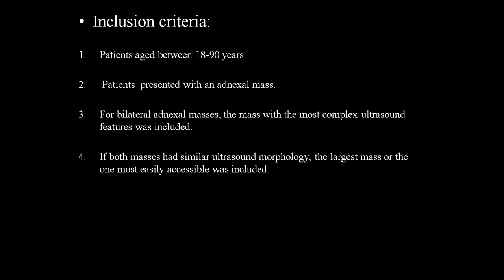Inclusion criteria: patients aged between 18 to 90 years presenting with adnexal masses. For bilateral adnexal masses, the mass with the most complex ultrasound features was included. If both masses had similar ultrasound morphology, the largest mass or the one most accessible was included.